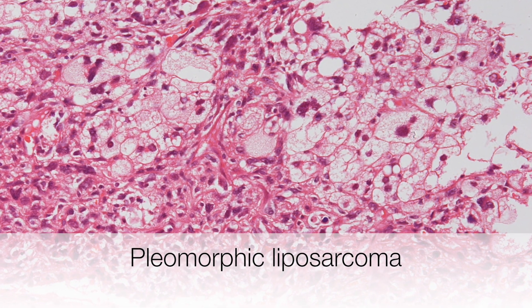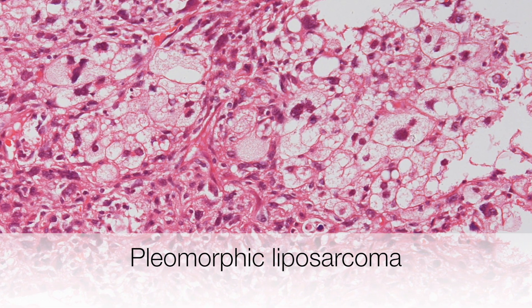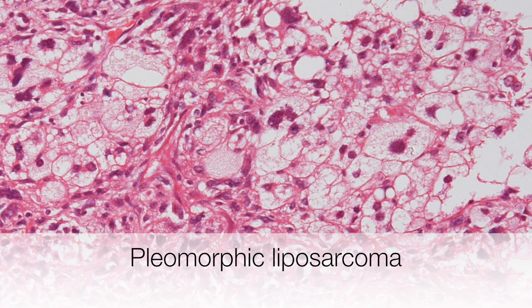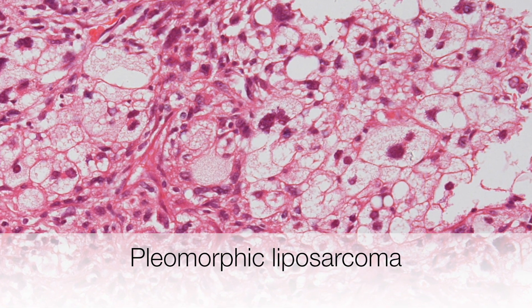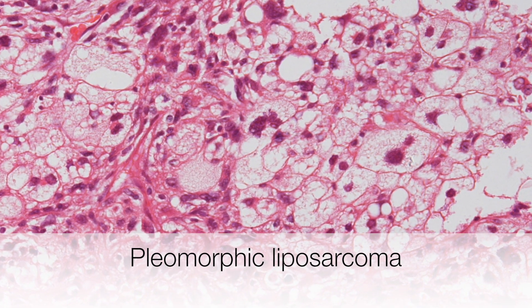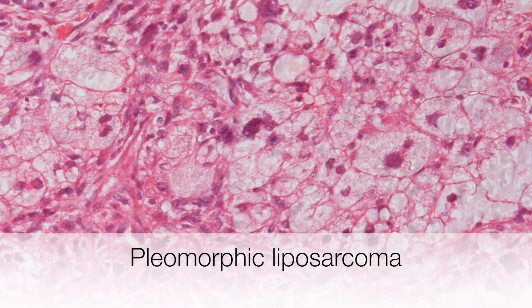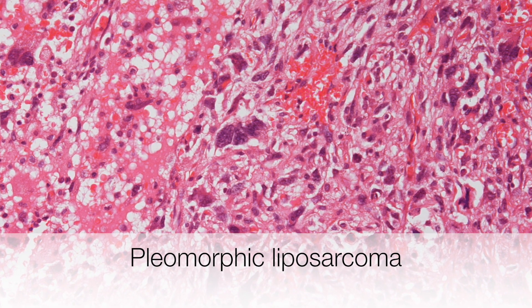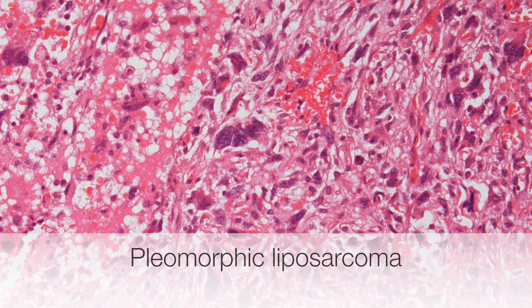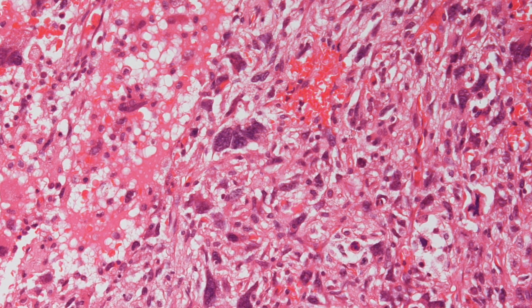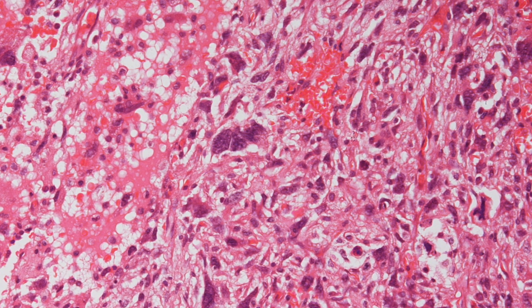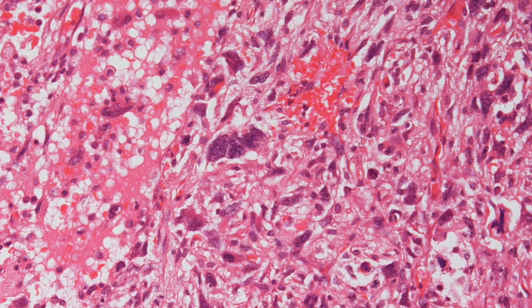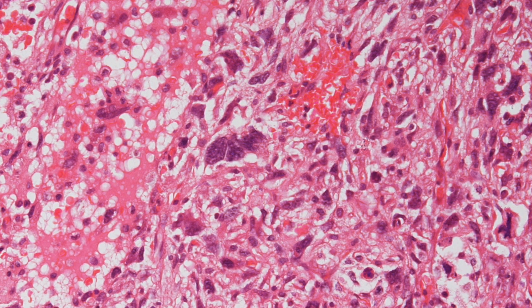This is another tumour of fat but this is a pleomorphic liposarcoma, a malignant tumour. It is called a pleomorphic liposarcoma because the cells and nuclei show extreme variation in size and shape.